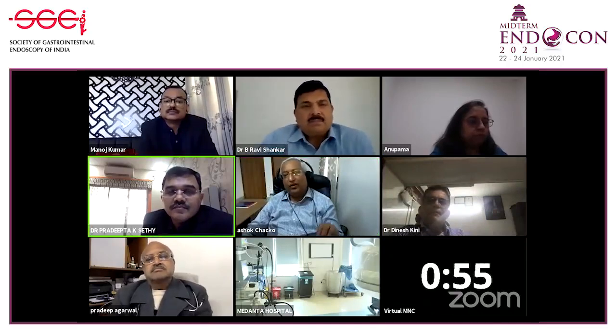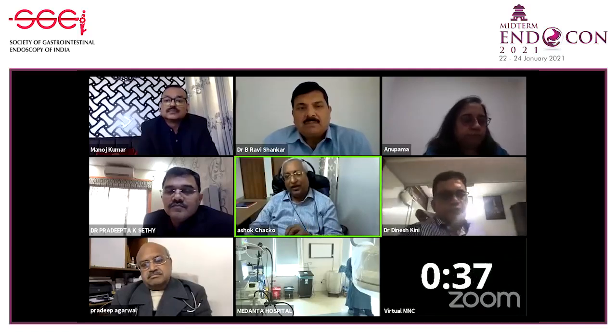Yes, thank you, Dr. Kini. If the bleed is not massive, I would still prefer to do a capsule endoscopy before going in for a double balloon enteroscopy, because it's a non-invasive procedure. It's easy to do. The yield to detect a lesion is high. And once we detect the lesion, if required, we can always decide the route of the double balloon enteroscope or single balloon enteroscope that we use. So in my view, I always prefer to use a capsule rather than a balloon-assisted enteroscopy.